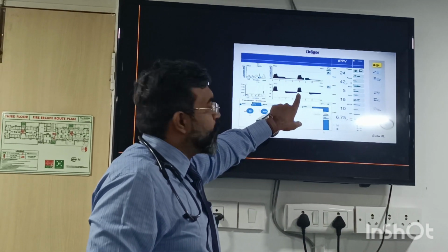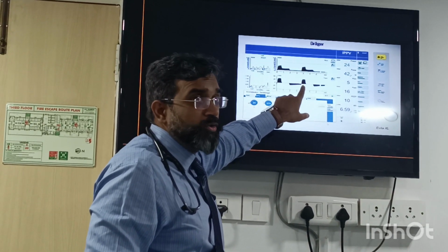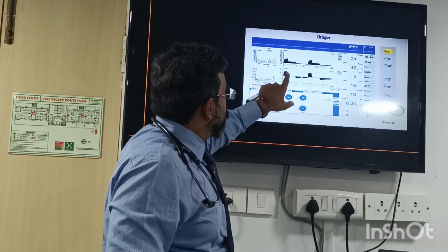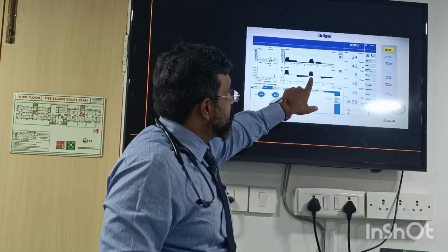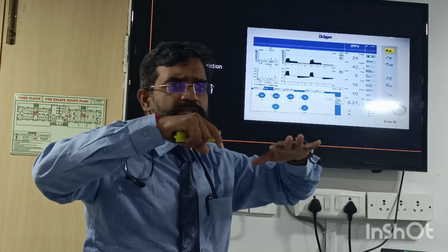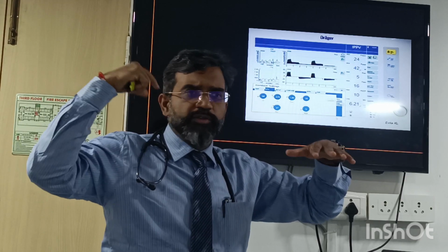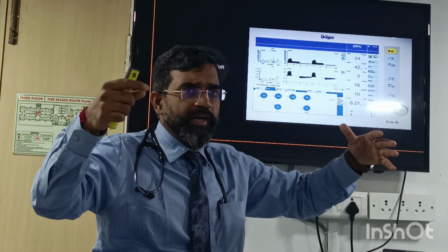This is called flow restriction. So on the waveform you should say this flow restriction is happening. Peak pressures may go up. Flow restriction will lead to pent up pressures in the body. Last time we did heart-lung interactions. It will reduce the venous return and the patient can have a cardiac arrest.